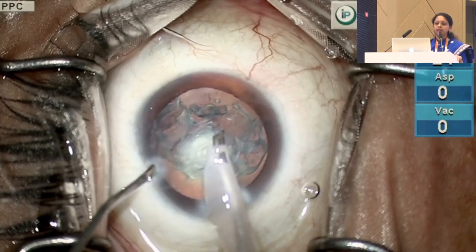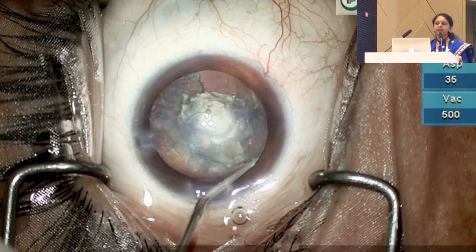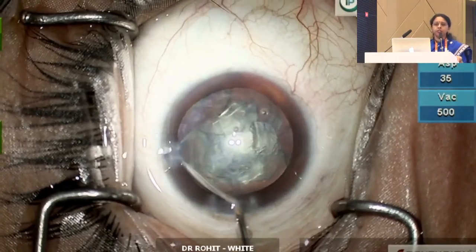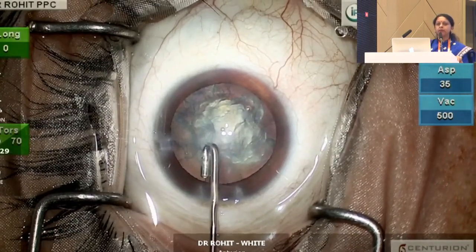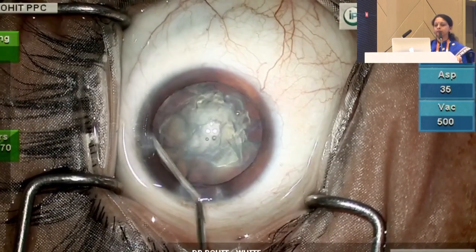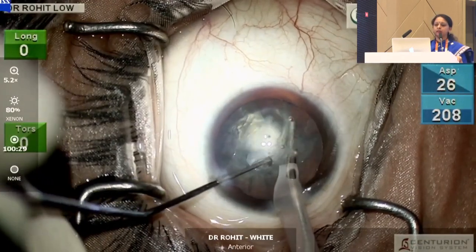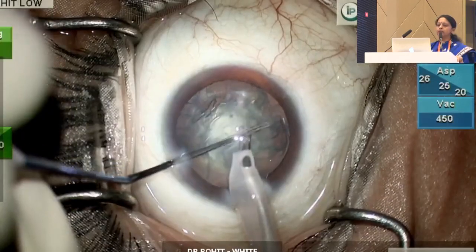Now visco is again introduced before taking out the probe, and to separate the remaining nuclear matter, visco dissection is done. Viscoelastic is introduced on two sides. Even subincisionally we have introduced visco using a J cannula. Now this nuclear material is remaining floating in the AC. We have further lowered the settings to 20 millimeters of mercury.